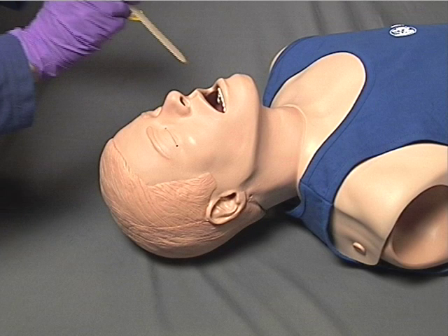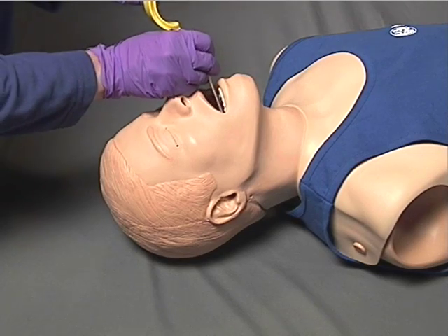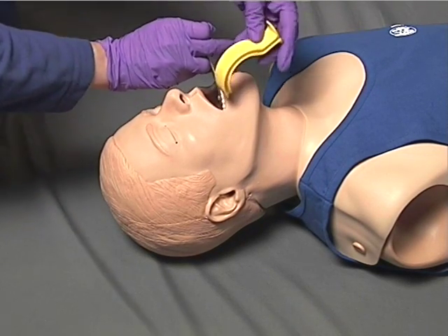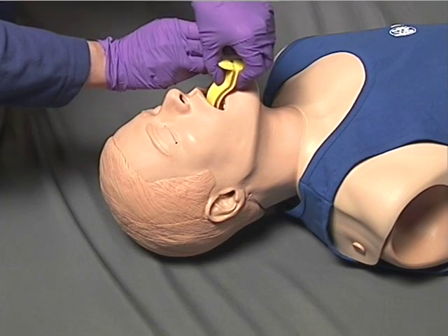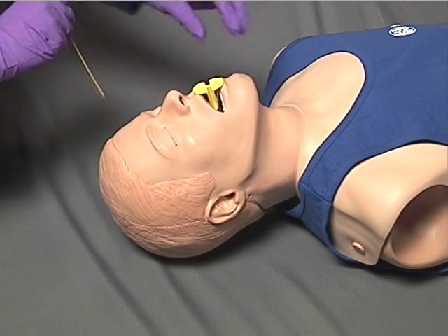As another option, the rescuer can also use a tongue depressor or other similar device to move the patient's tongue forward and down. The oral airway is then inserted into anatomical position so as to follow the normal curvature of the oropharynx until the flange rests against the lips or teeth.